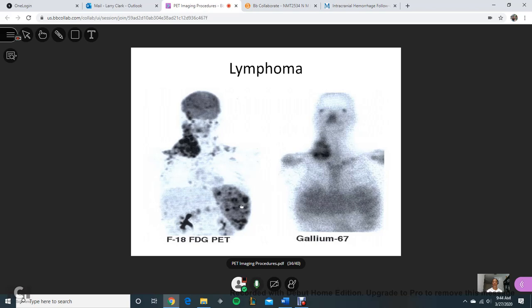Like in this, right. Those are the lymph showing up, the dots. It's a lot. Because lymph circulates, and that's the most important thing that you guys have to remember, that it circulates. So if it's circulating and it's in that area and doing what it's doing, that's where it's going to be. So what's this area?